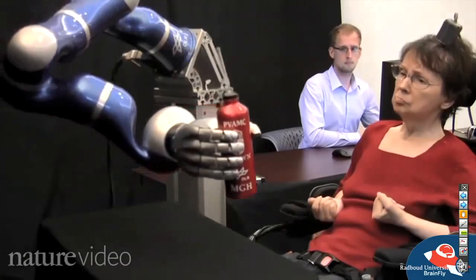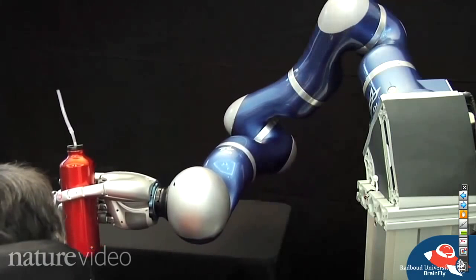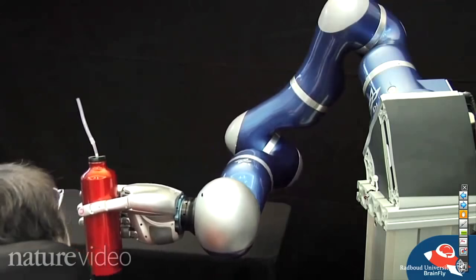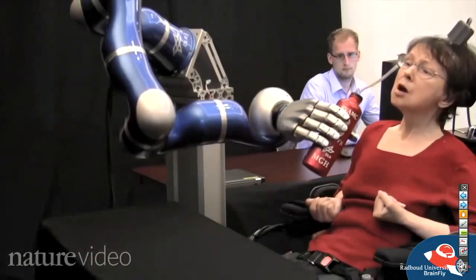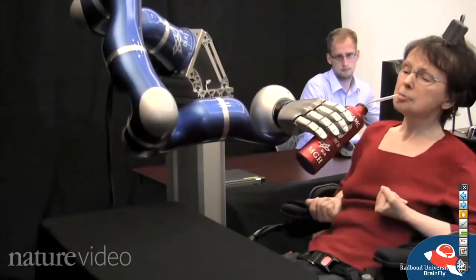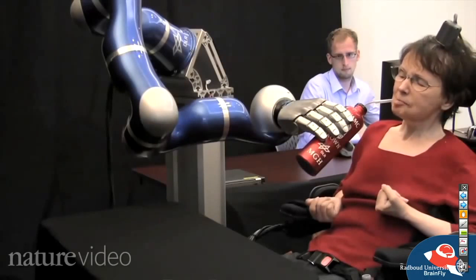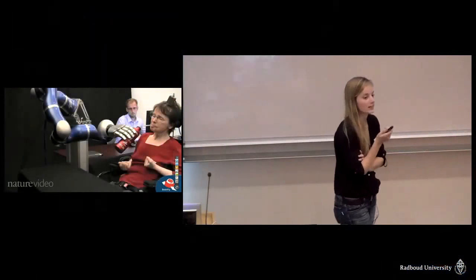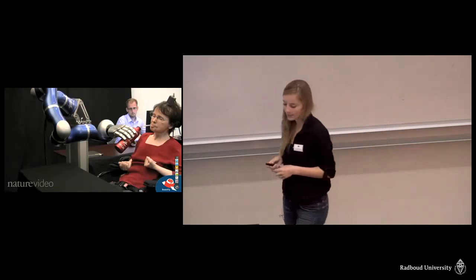So the guy in the back is not secretly controlling this. He's just making sure that the robot arm doesn't go all places. So she's doing this herself. It does take some training, as in the computer needs to recognize which brain signals from your brain correspond to which movement or which action you want to take.